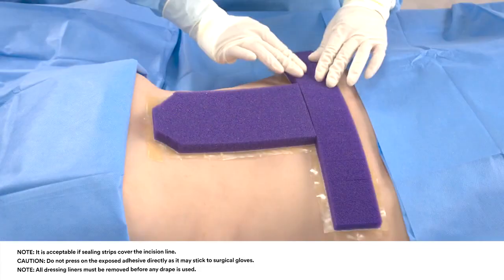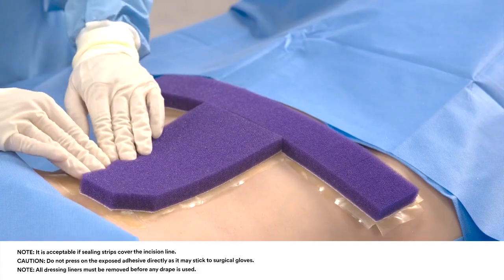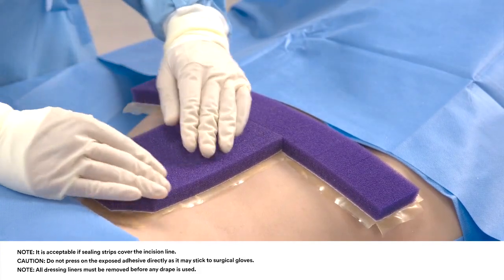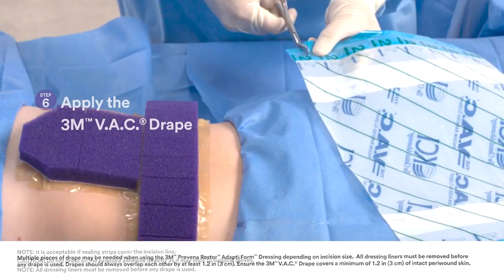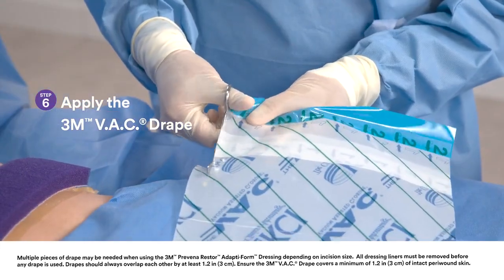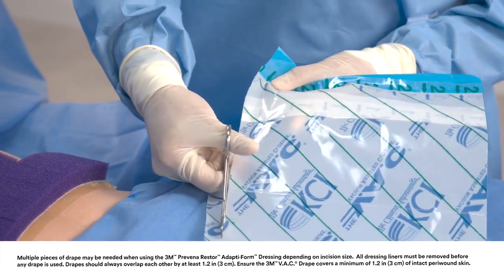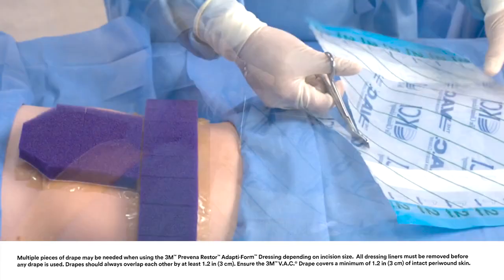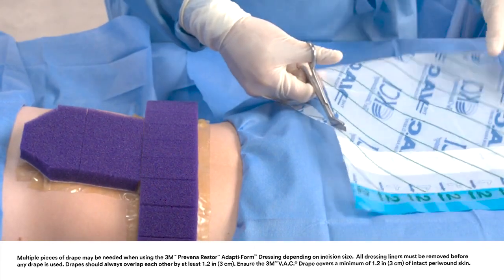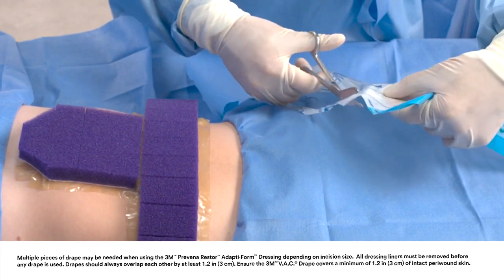Once the foam dressing has been applied to the incision, ensure all liners are removed before continuing with the drape application. Trim the 3M VAC drape as necessary. Ensure a minimum overlap of 1.2 inches or 3 centimeters when using multiple pieces of drape. Ensure the VAC drape covers a minimum of 1.2 inches or 3 centimeters of intact peri-wound skin.